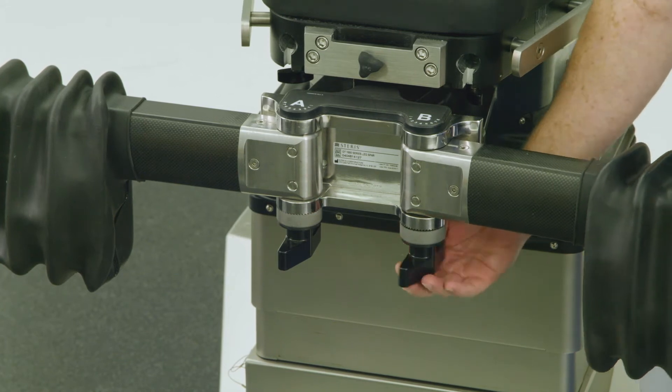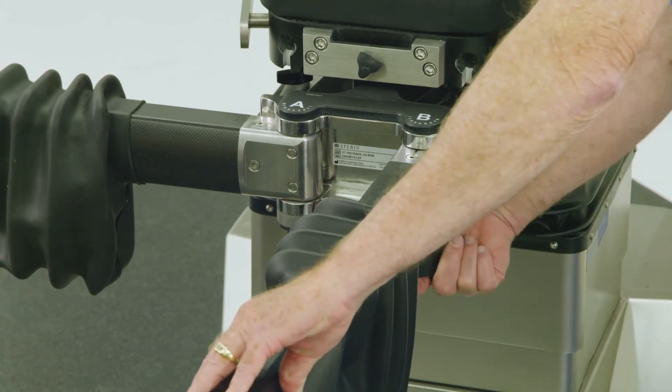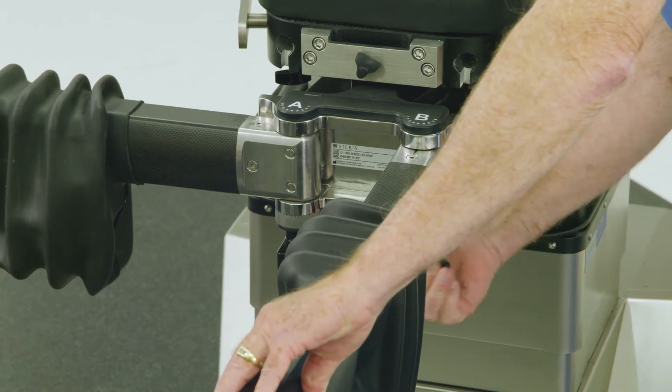Next, loosen the knob below the right side B rosette, and set the B joint to position 4, then relock the B rosette handle.